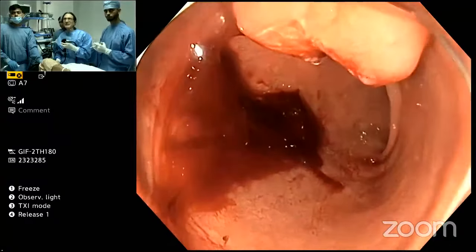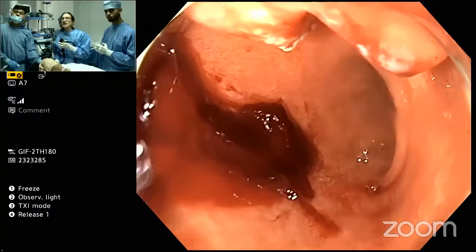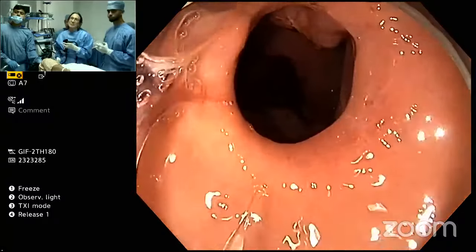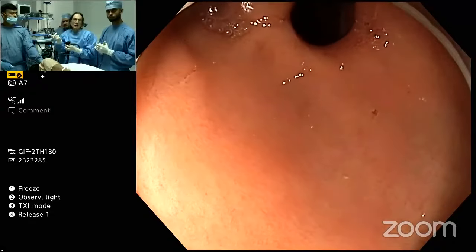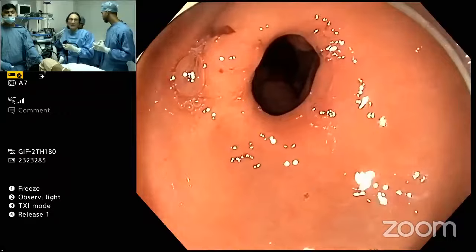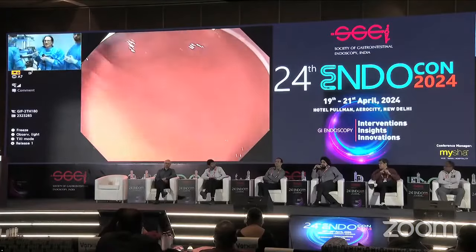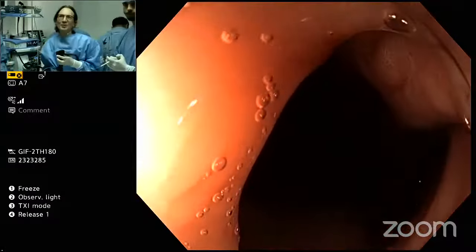All right, so now this is the base of the area here. And so now the next question, I think, is what do we do about this base? Should we clip it? And I would say yes. I think we should just throw a clip. The best would be a nice wide-pronged one, like a 20. There's now a 20 millimeter clip. So a nice big clip. I don't know if we have those. Those are great. Is this clip to prevent bleeding prophylactically, or do you want the remnant to fall off? Only to prophylax against bleeding.